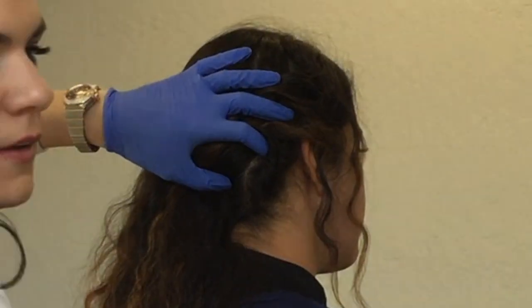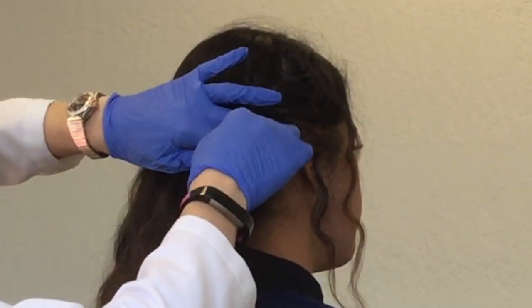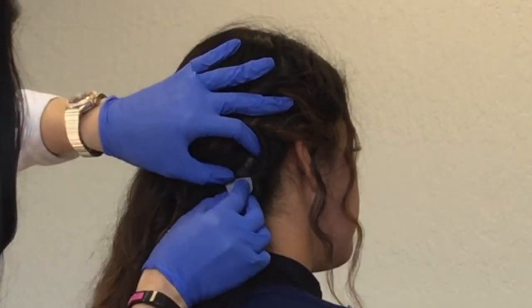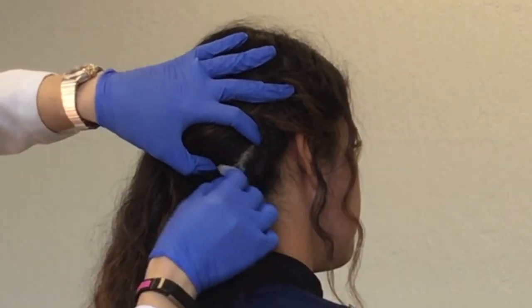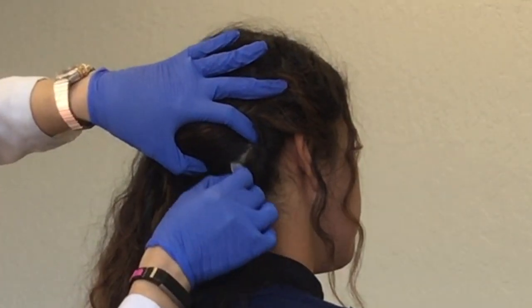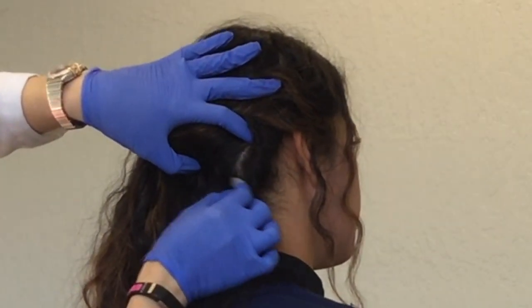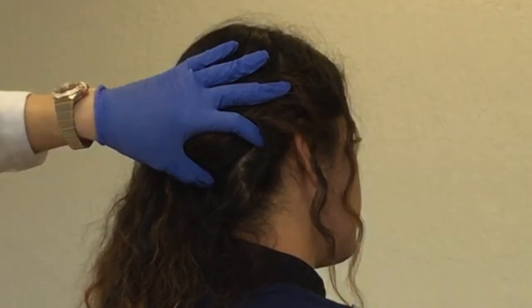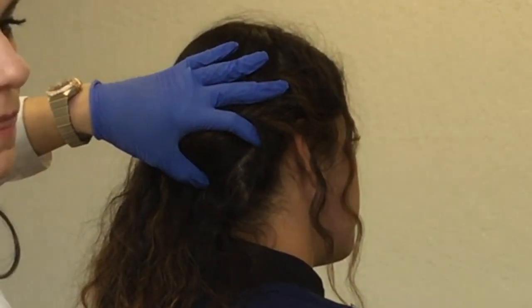Next, clean the injection site with alcohol and let it dry. It's not a sterile procedure — it is aseptic — so you don't have to worry about infection. There is a very low risk of infection with this procedure.